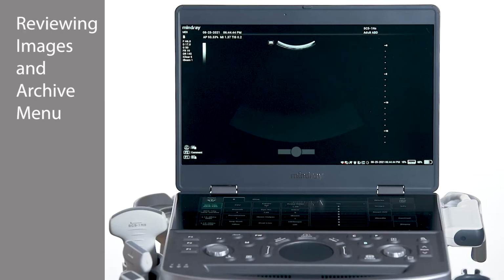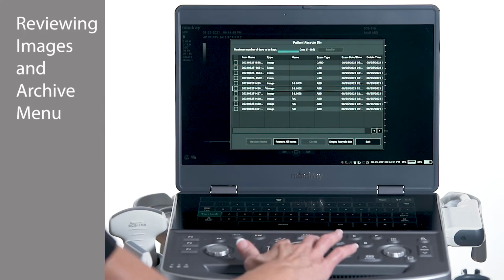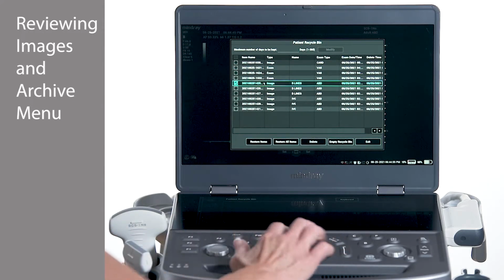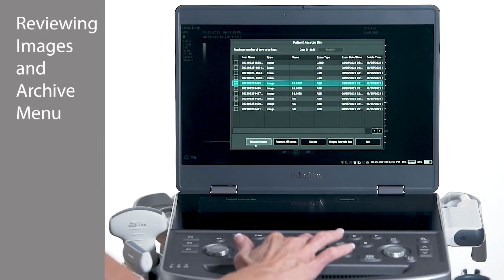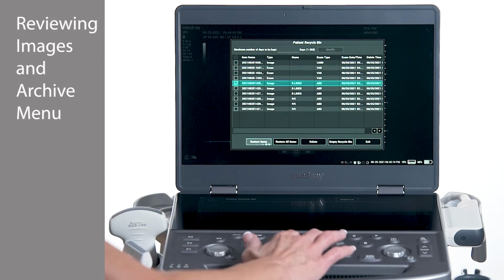The Recycle Bin is a tool that will allow retrieval of accidentally deleted studies. Select the Recycle Bin icon in the bottom right toolbar using the cursor to view deleted studies. To retrieve a specific study, highlight that study and then click Restore. This will send the exam back to the iStation archive. It is recommended that the Recycle Bin is emptied after deleting studies to keep the hard drive from getting too full.